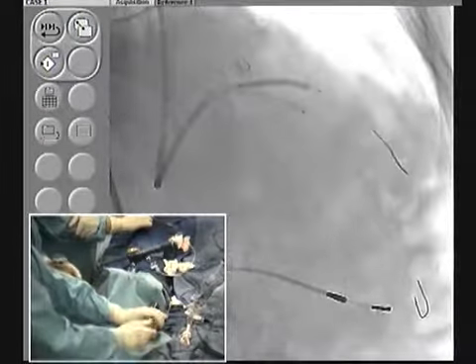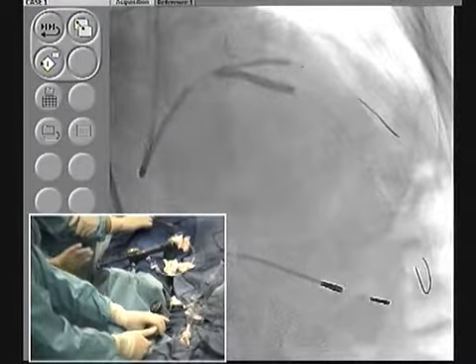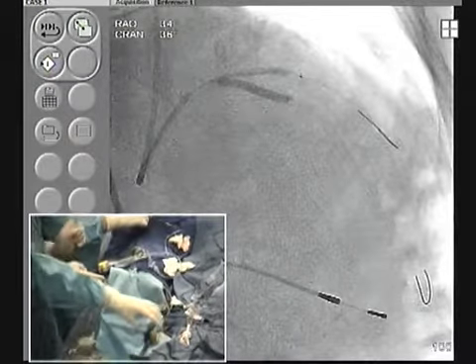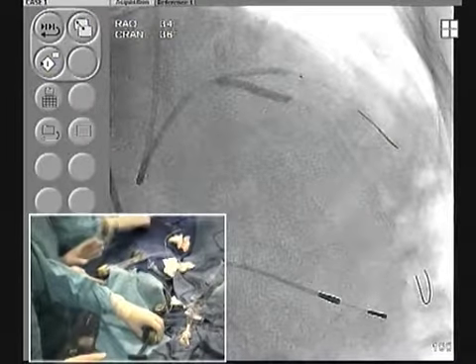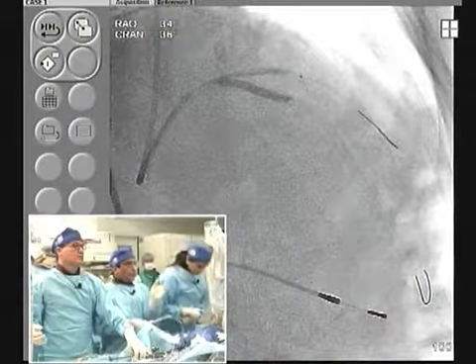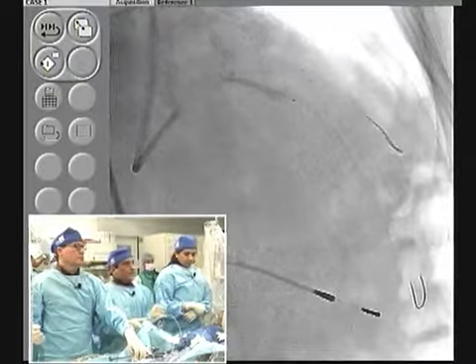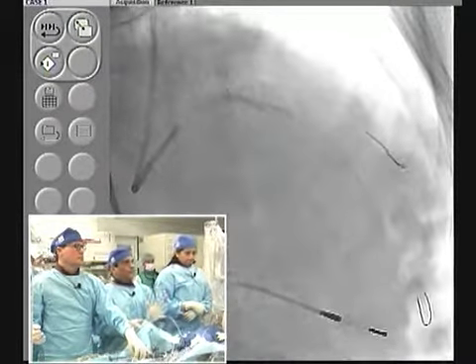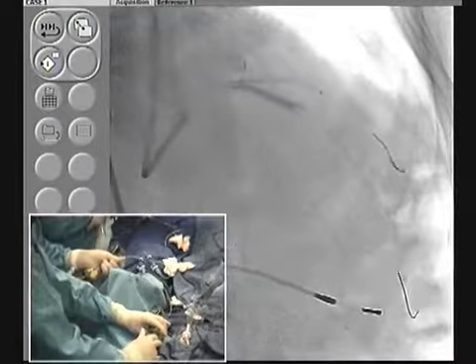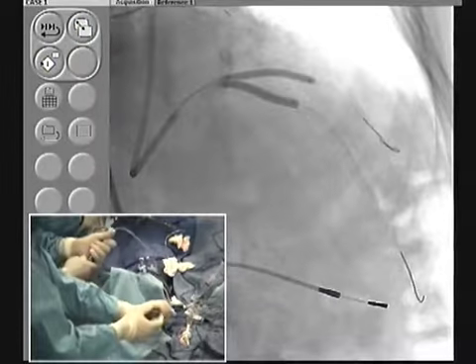Now you go up. Then the LAD, that's a third, 12. Good. High pressure, full expansion. Negative. Deflate again. The last inflation actually becomes more important for the distal left main when you have a totally occluded RCA, because if the patient is hemodynamically unstable, you may need to give a little neosynephrine because you want your final inflation well expanded. Go back again, but the patient here is tolerating very well, 12. Both at about 10 to 12 atmosphere. Down. Negative, good.